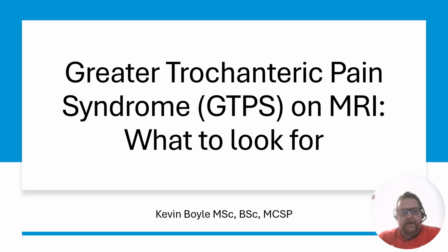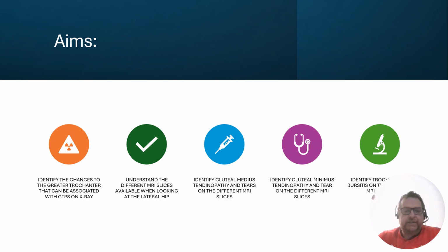I'm Kevin and this video is the fourth part of our 5-part series on all things GTPS. So far we've talked about the risk factors for GTPS, the assessment, as well as treatment including patient education and treatment adjuncts, and today we're diving into the imaging. In this video we're focusing on exactly what to look for when assessing GTPS on X-rays and on MRIs.